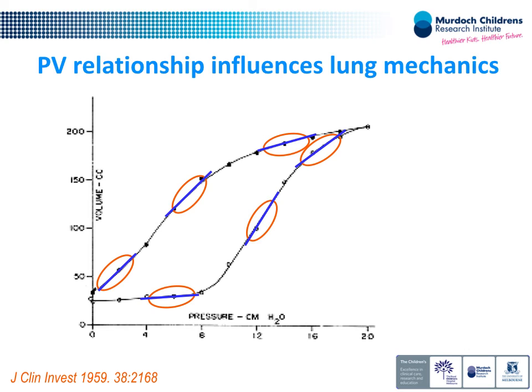Yeah, but I think in conventional it is entirely reasonable. The adult people do it in conventional. Maybe they said lung recruitment. We changed it to lung optimization. Some other terminology. People appreciate that we can go up, go down, and it doesn't matter which you go. But again, I've discussed this a bit. Once you put the word optimal in, that is such a nebulous term. And I can tell you, everywhere I go, everyone is optimal in their ventilation, and everyone is protective in their ventilation. Okay. But I'll discuss this when I talk tomorrow morning also.